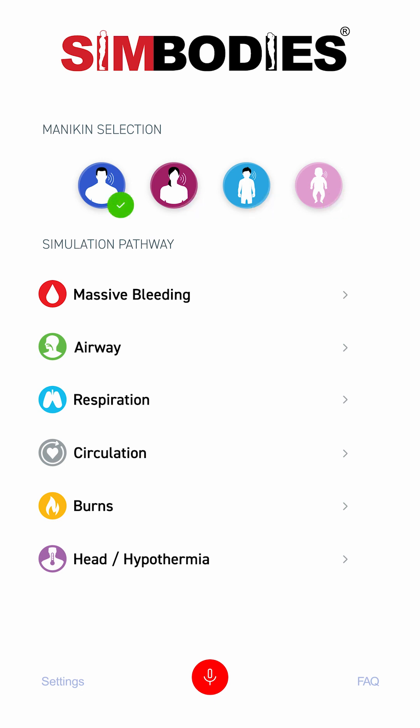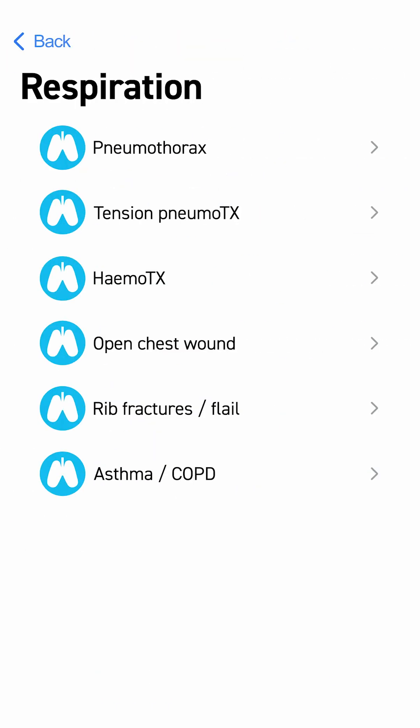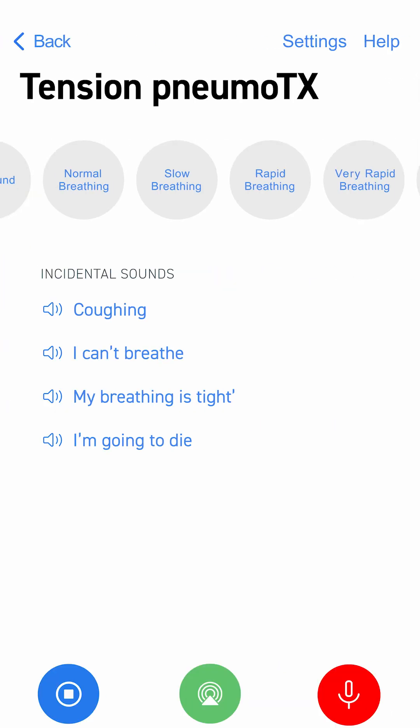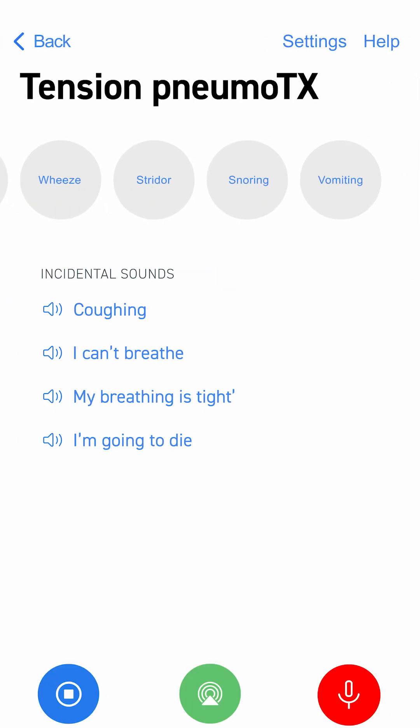Choose the type of training — for example, respiration. Then select the relevant trauma associated with your scenario. Here you can choose from a selection of pre-recorded sounds.